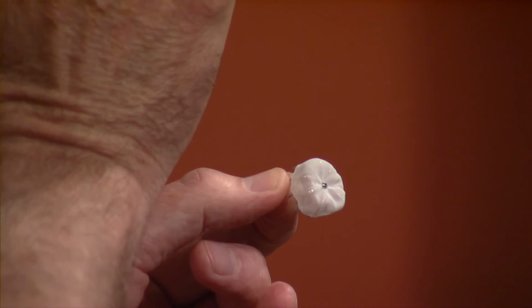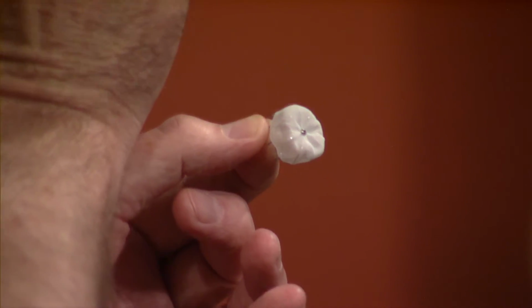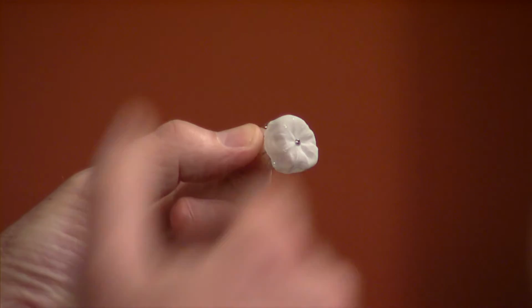Is that the most common place for a blood clot to occur in the left atrium with atrial fib? That's exactly right. And you've got something that can plug up that problem. We do. This is called a Watchman device. Again, it's delivered through a catheter, and you can see it's a stent-like device, but it has a covering on the back. And so it plugs up the appendage, and when it does, it heals into place, no blood clots.